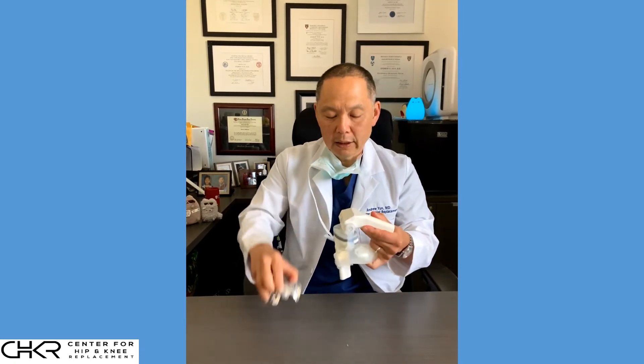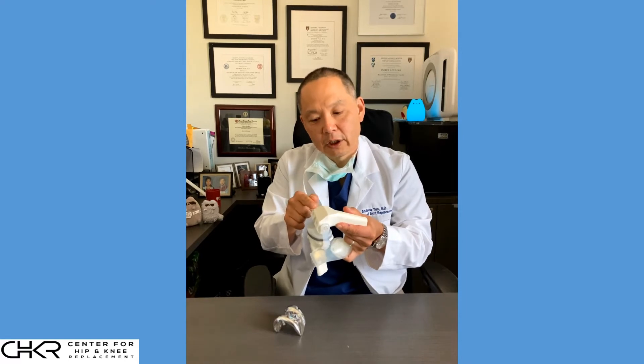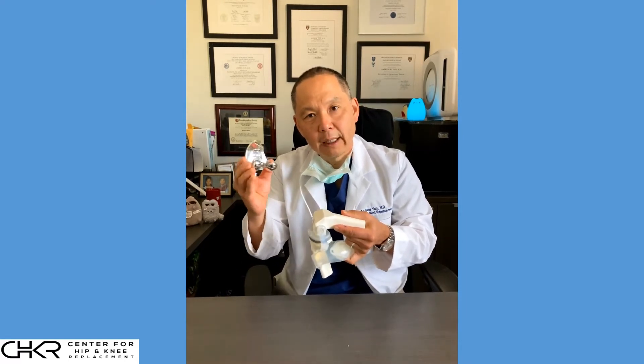When we talk about a knee replacement, we're not taking out all the bone in the knee and putting in a new knee. What we're doing is shaving off a few millimeters of the arthritic cartilage at the surface in a shape that will match the same shape of the implant.